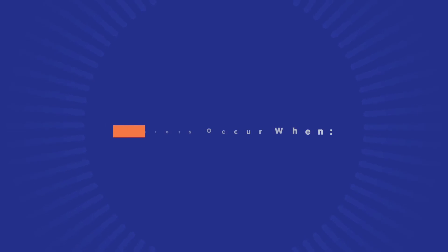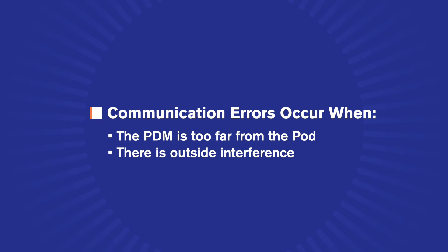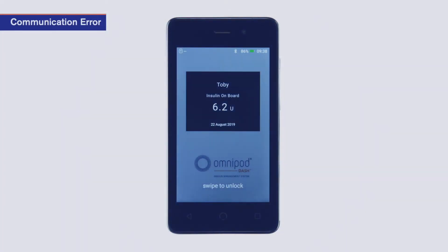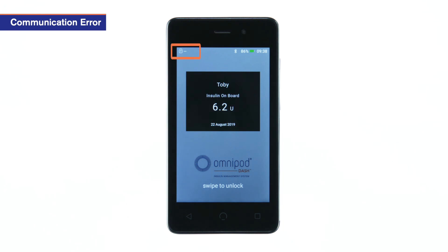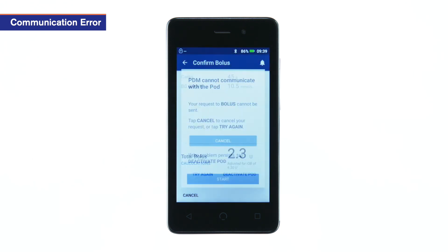A communication error generally occurs when the PDM is too far from the pod, or communication is disrupted by outside interference. The PDM may inform you of this state by displaying two dashes in the status bar. Seeing these dashes is common and resolvable. If the PDM is unable to connect to the pod, you will receive a pod communication error.